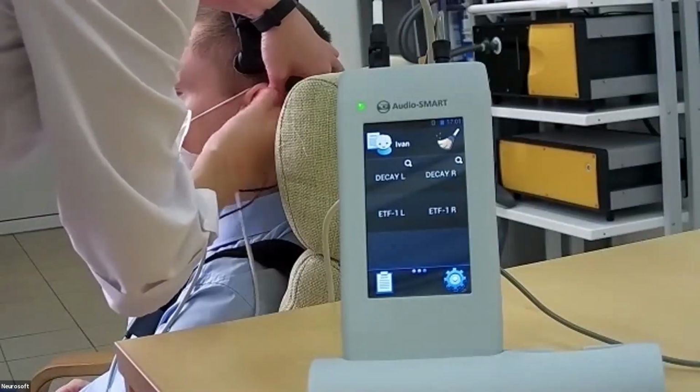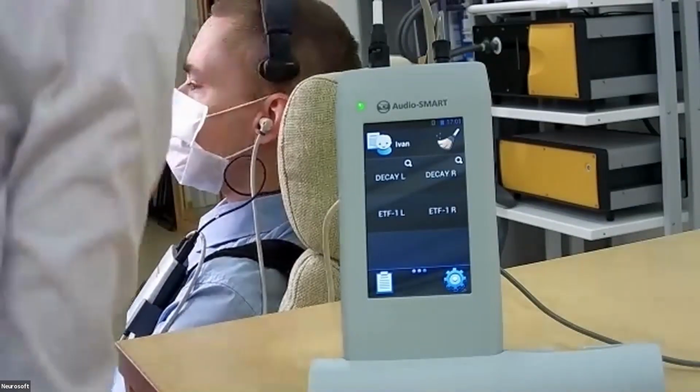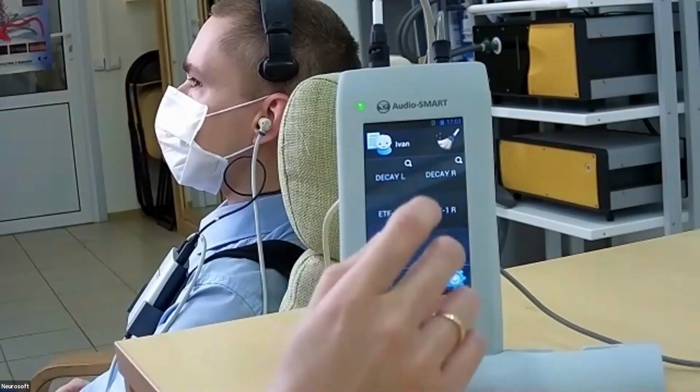Because of the Valsalva maneuver, the peak went out. Okay, let's try one more time.